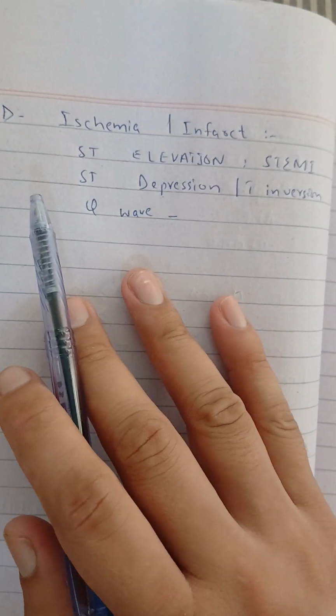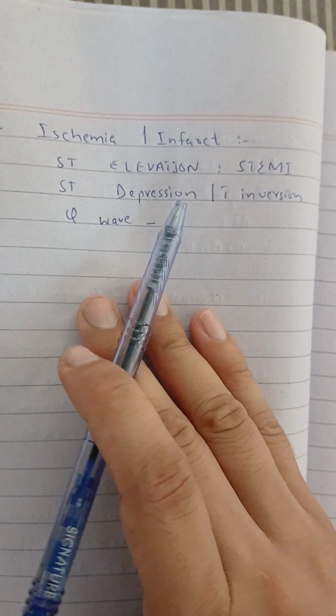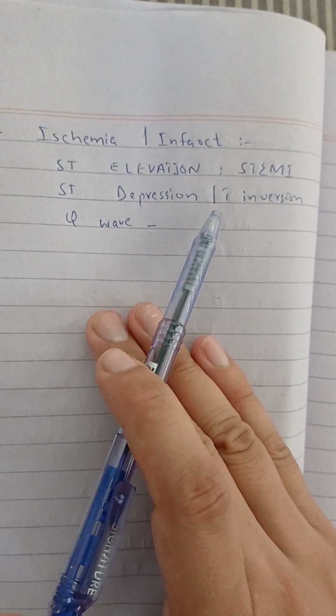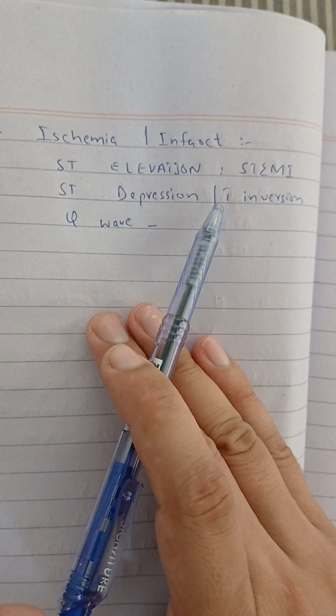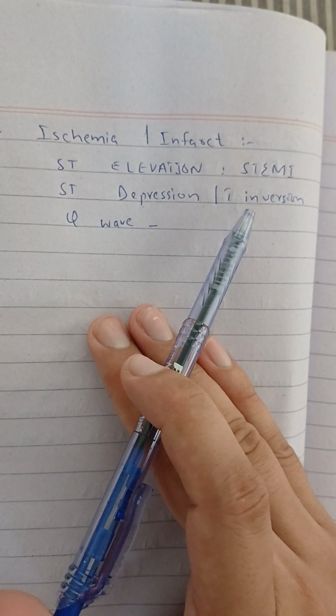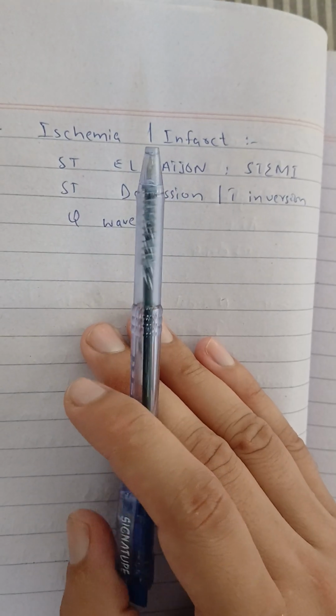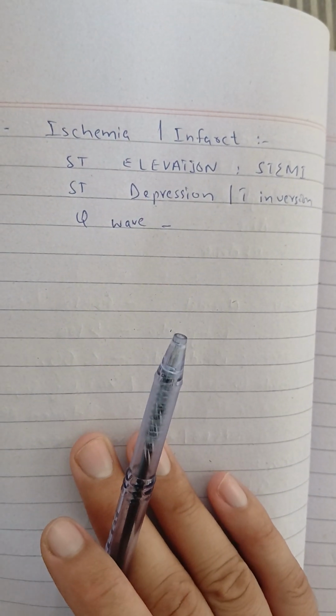And number 4, ischemia or infarct. For ischemia or infarct, we see ST elevation, which basically occurs in myocardial infarction, or ST depression or T wave inversion. These all occur in myocardial infarction.